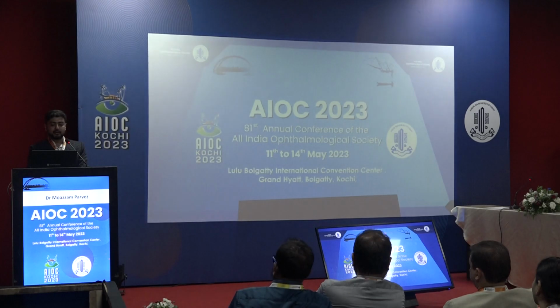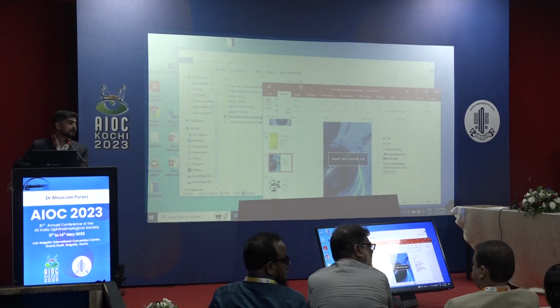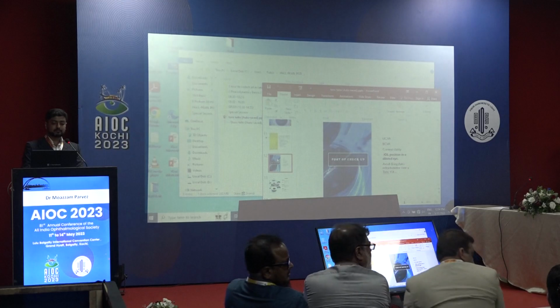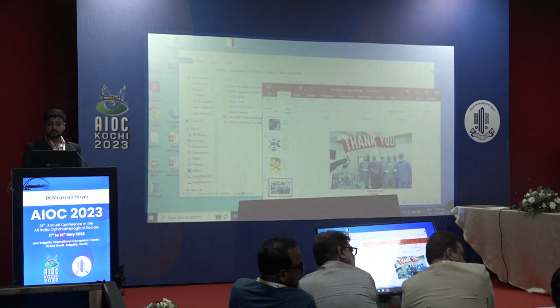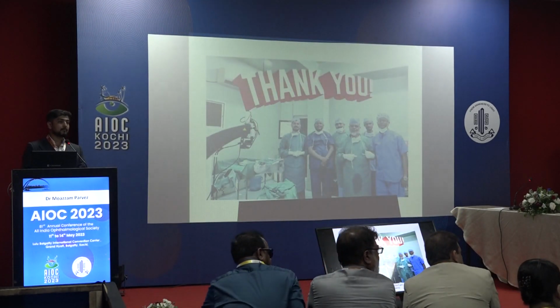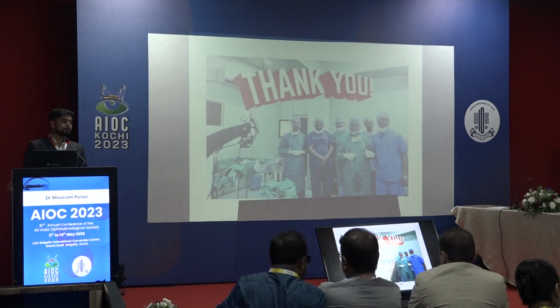In the meantime, I'll ask Dr. Parag Mukherjee, you do a lot of SICS surgery, high volume. Is there any place of toric IOL in your surgical practice of SICS? What percentage of cases do you do toric IOL in SICS? Not many. When I find a gross cylindrical disorder, then I use.